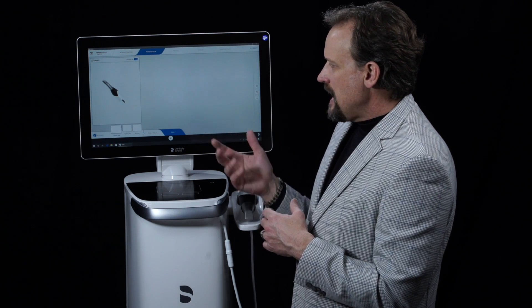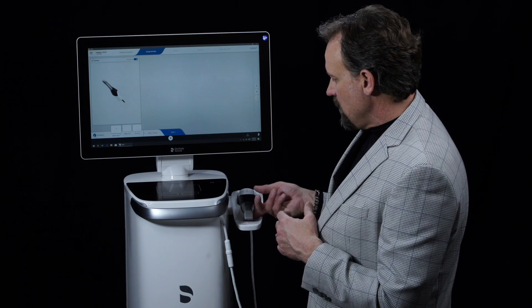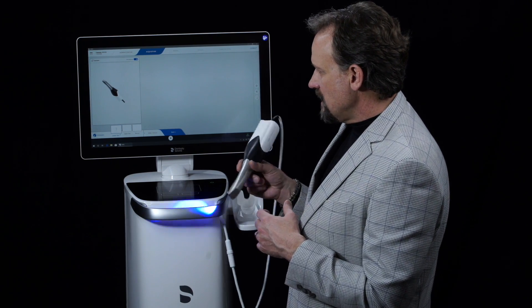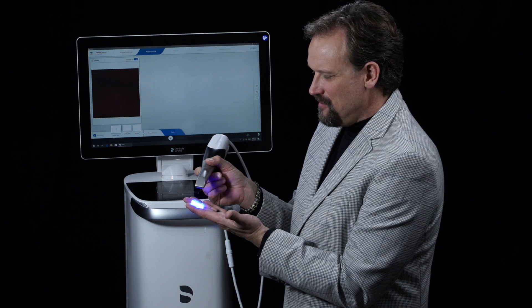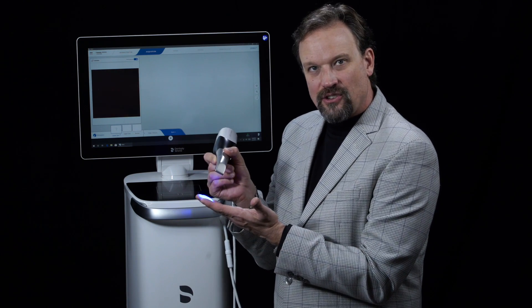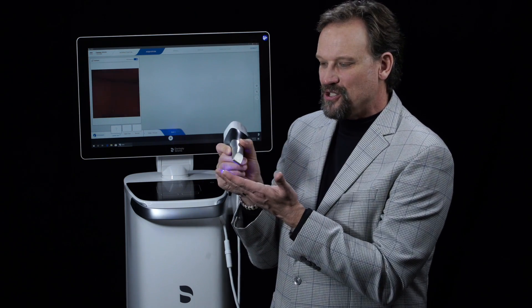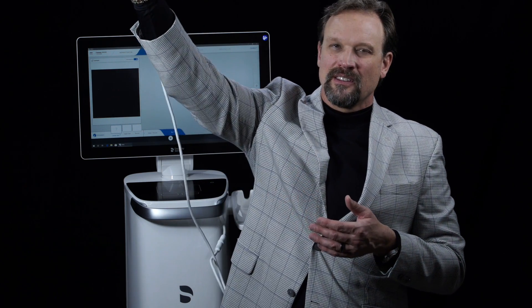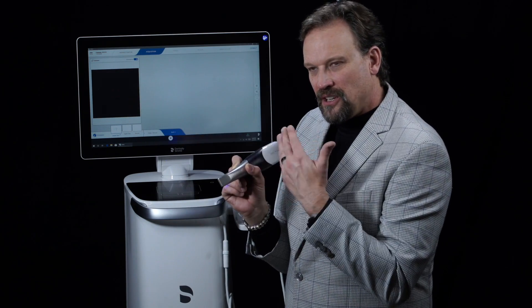Coming into the acquisition phase, I'll pick up the camera and it kicks on automatically. You can see the blue light — that smallest wavelength frequency. And there's a little bit of a rattle. I'm going to hold it up to the microphone so you can hear it. That's the dynamic lens working.